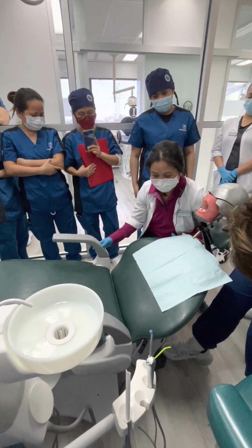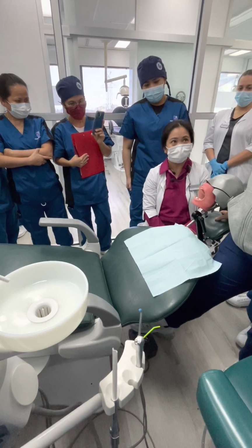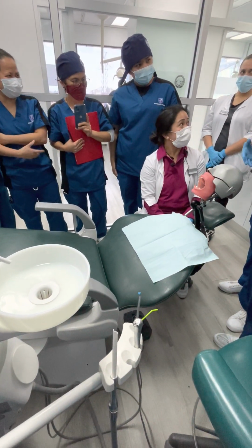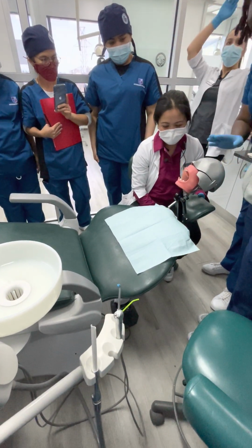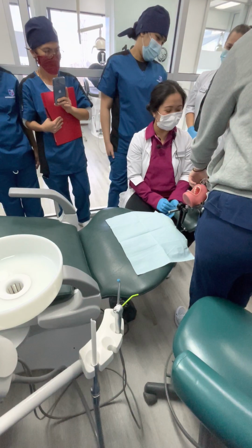That's not supine. Now you've got to go back. And this one has to be taken in a second, not an hour of just putting the patient in supine position. Is this good enough for you? What if they're heavy? Just make sure that they're able to breathe, but don't put their legs over. Why is his head like that? He's not even relaxed. Yeah, ask him to relax. Okay, very good, Marie.